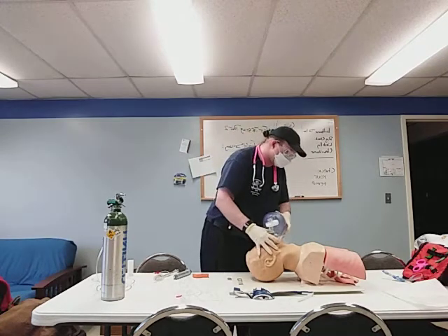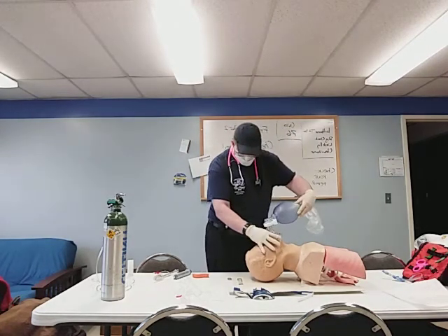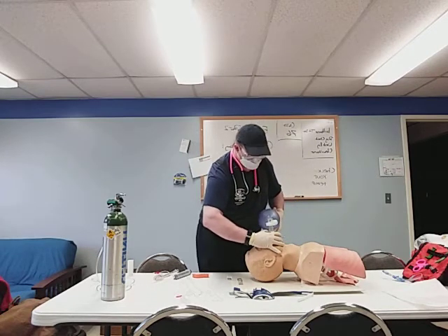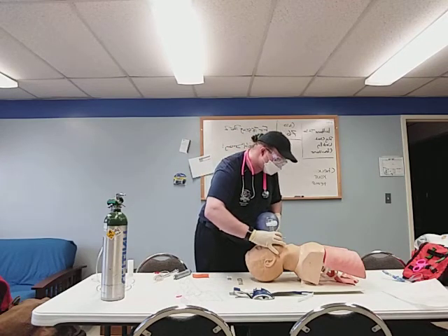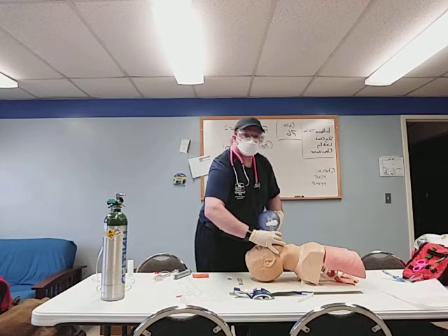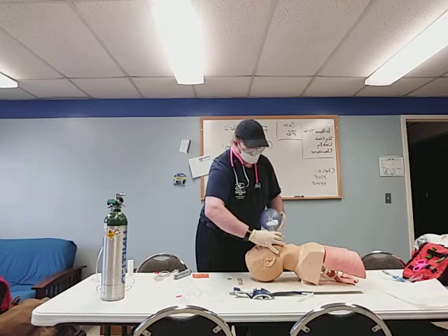Try not to talk too much. Now we've got a good seal. All right, I've got good chest rise. I'm going to ventilate every 5 to 6 seconds with the goal of achieving 10 to 12 respirations per minute.